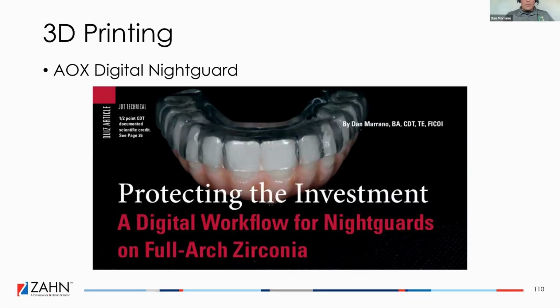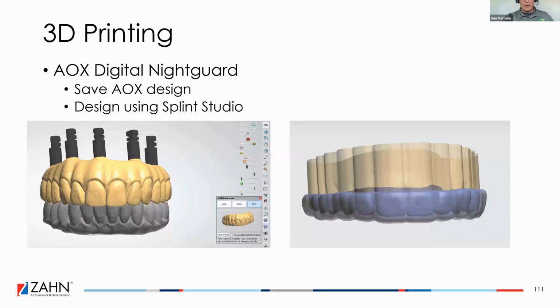This is the article we did with Zon maybe 2 months ago now. And then we'll go through the workflow here. It works really, really well. You're not asking for any new scans. You're not waiting for this. This is delivered at the same time as I delivered the All-on-X.